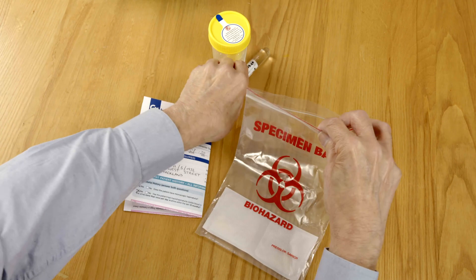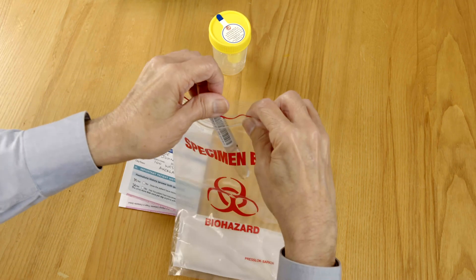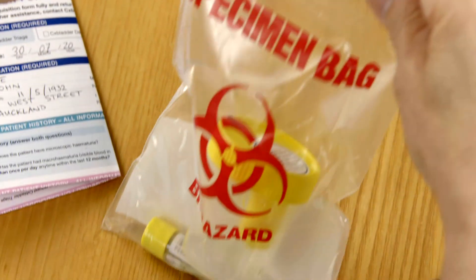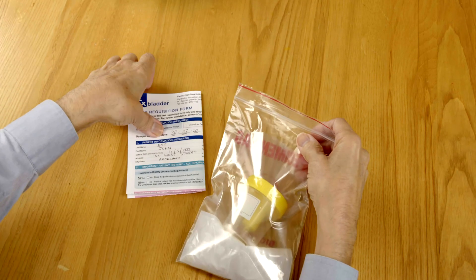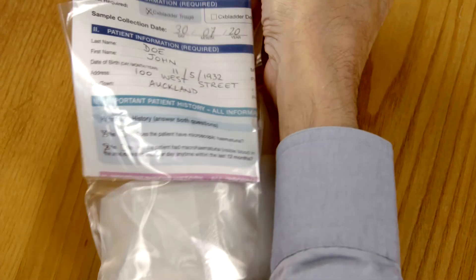Place the CX Bladder tube into the plastic specimen bag with the absorbent pad. Then place the empty CX Bladder collection cup into the bag with the CX Bladder tube and seal the bag. Insert the completed test requisition form into the document pouch on the side of the specimen bag and place the bag into the empty CX Bladder box.